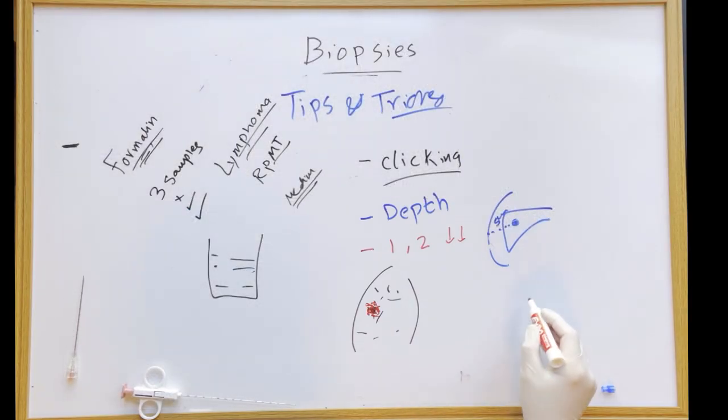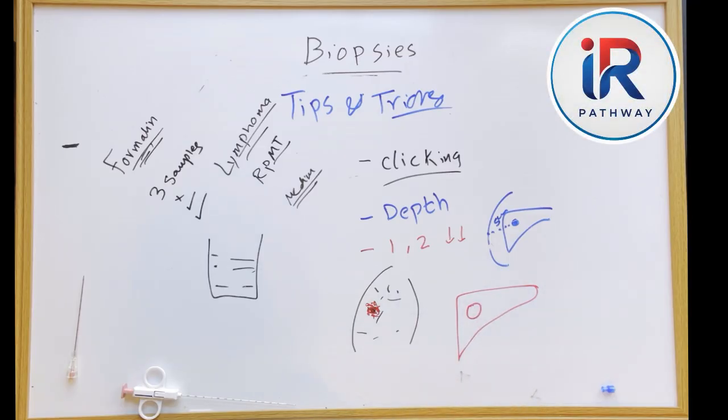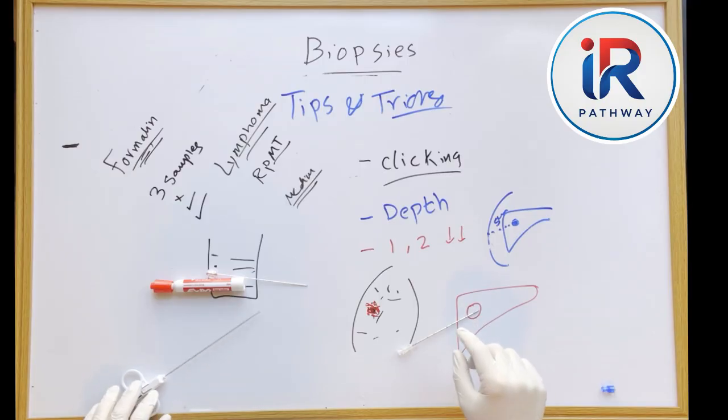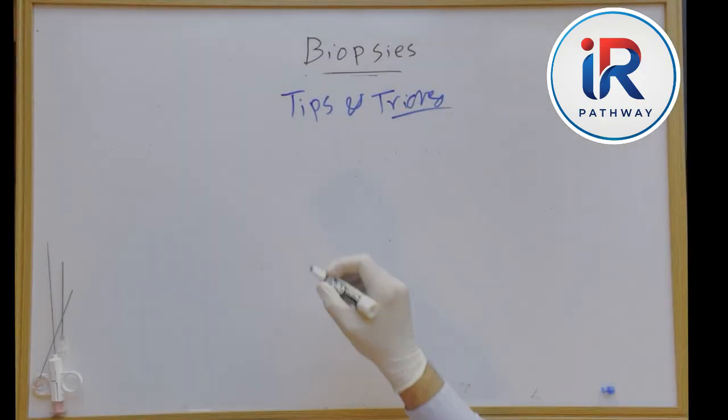The same principle applies to the liver biopsy, where a coaxial needle is usually used. Each time you advance the coaxial needle, you remove the inner stylet and insert your biopsy needle. You introduce air as well, so some echogenicity starts to appear within the lesion. As the echogenicity increases, visualization becomes more difficult, especially if you are performing the biopsy under ultrasound guidance. So, don't rush. Beginners often feel the need to take samples quickly. Take your time with the first and second samples, as they offer the best chance for a good quality sample.